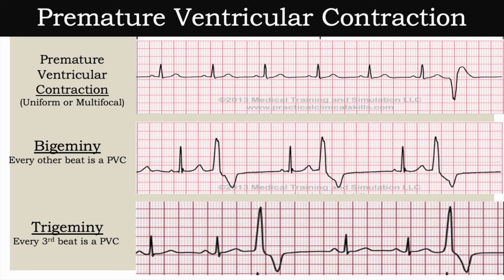Again, if you have one PVC, it's fine. Sometimes we have PVCs, like if we get scared of something or whatever, you will have a PVC. Now, if you have more than one, you do have to treat it, okay?